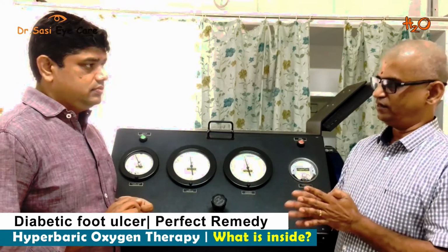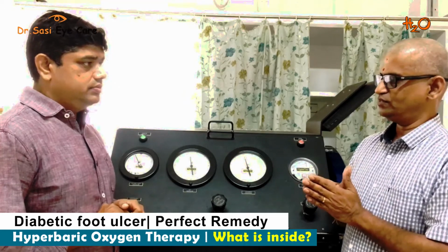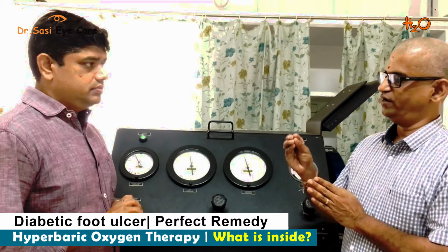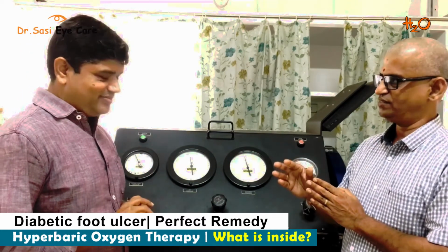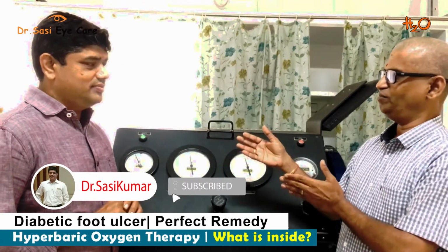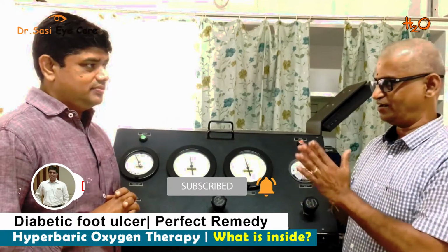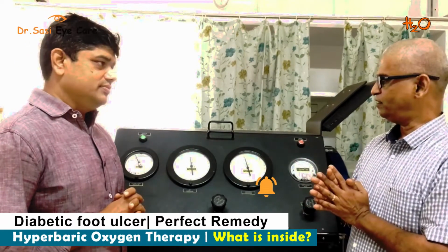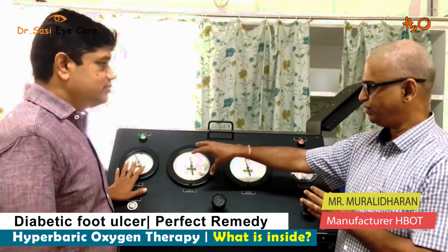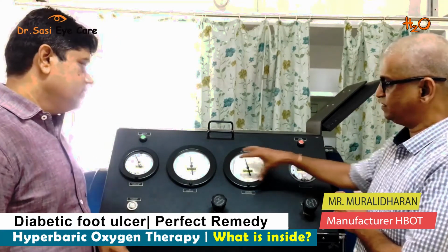Depending upon the clinical condition and indication, these three things vary. For example, if you take a tablet, the same tablet is prescribed for one indication for X number of days and doses, and for another indication it's prescribed for a longer time and higher potent doses. Same here. We consider oxygen as a drug, which is a natural form. The things you showed are all pressure gauges to monitor the pressure inside and the duration, how long they should take; all these gadgets indicate that.